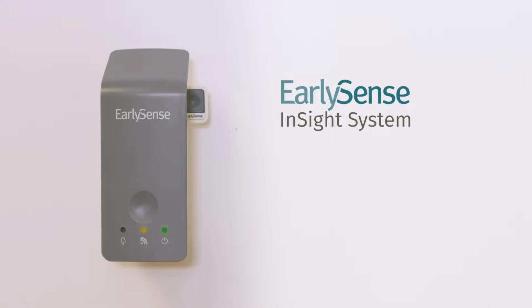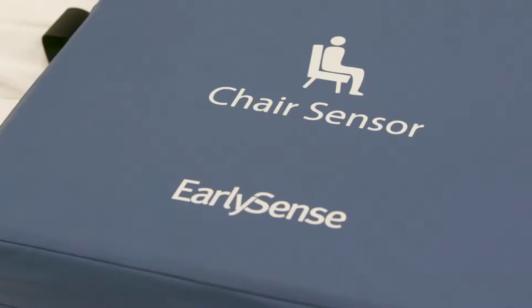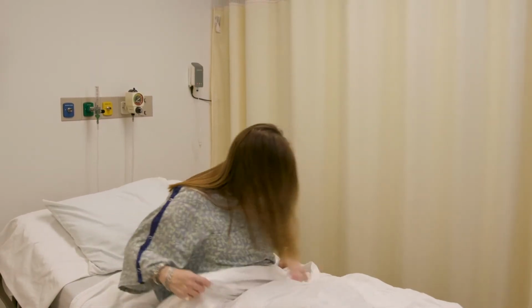This video will demonstrate how to utilize the bed exit functionality for fall risk patients. For any elaboration on how to operate the EarlySense system, please refer to the relevant user guide provided upon installation or online at earlysense.com. The sensor can detect movement in bed or chair. When a patient is moving away from the sensor, it might indicate a bed or chair exit attempt.